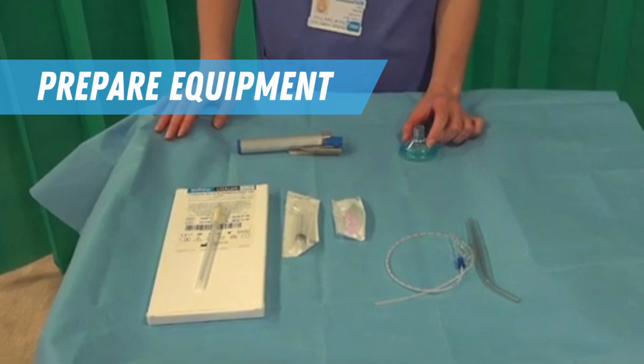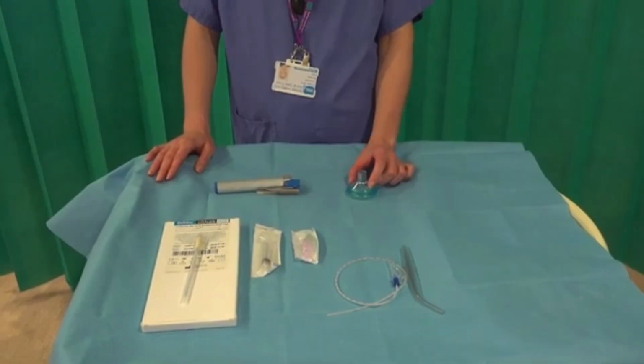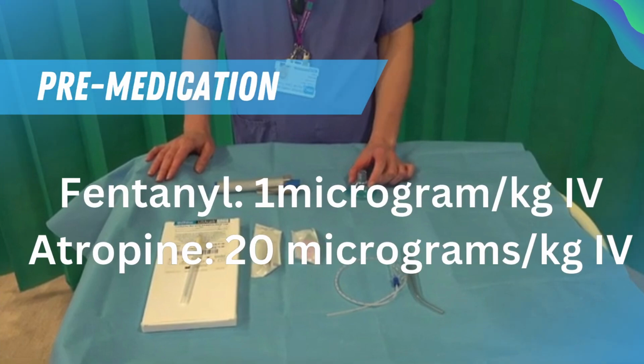You will need a LISA catheter, laryngoscope and appropriate volume of surfactant in a Luer-Lock syringe, as well as a face mask, Neopuff and suction catheter in case of deterioration. Whilst LISA is less invasive than an intubation, it is still a painful procedure for a baby, and if the baby is very distressed, it will make the procedure more difficult.